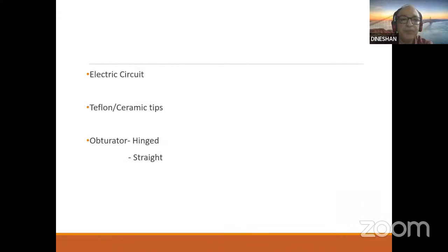From the loop, the current is going to the tissues, and from the tissues it is passing through the patient, and then you have the base electrode, that is the diathermy plate, and through that the circuit is completed. From the loop, through the tissues, through the patient to the diathermy plate, that is how the electrical circuit is completed.